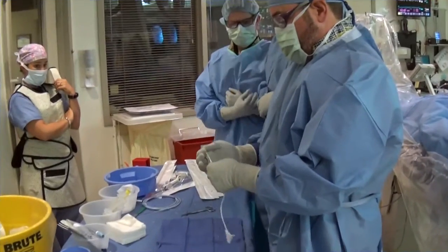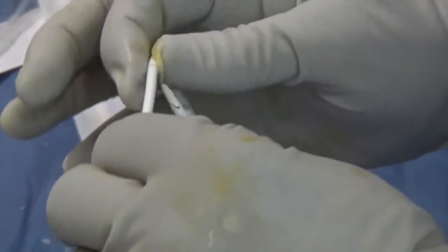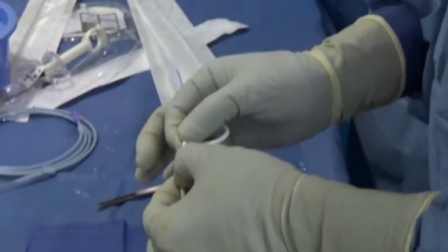So as you can tell, the side holes are only on the inside of the catheter here, but we want to have a catheter that has side holes all the way out to this part right here.